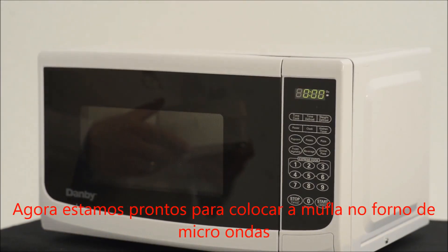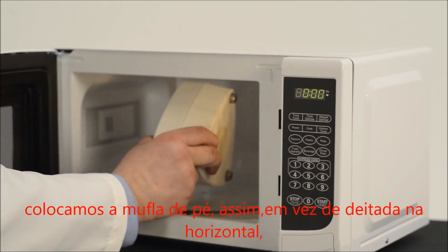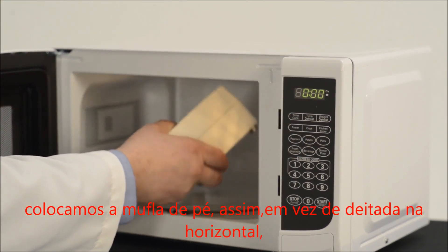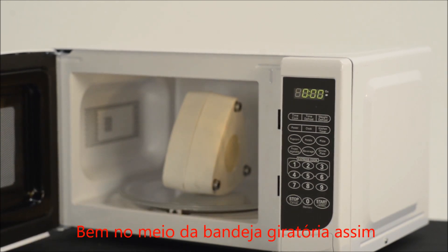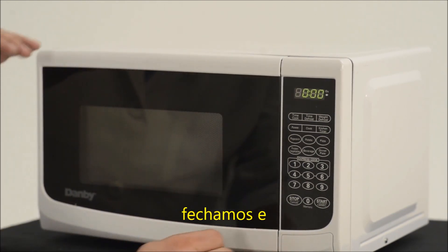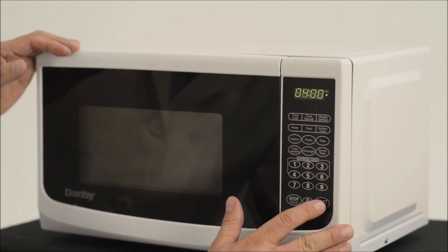Now we're ready to place the flask in the microwave oven. We want to stand it up like this, as opposed to laying it down, because we get a more thorough cure that way. So right in the middle of the plate here, in the turntable. We close it. We're going to cure this for four minutes. Start.